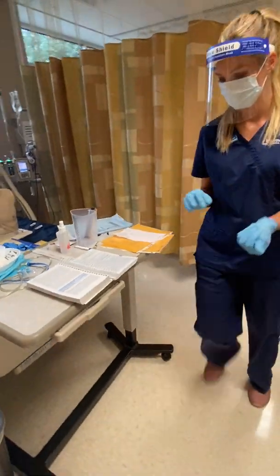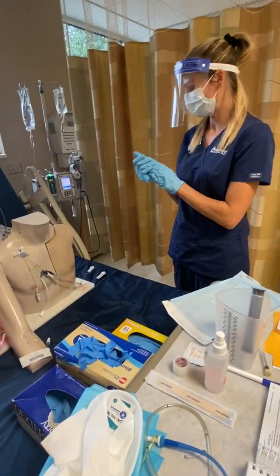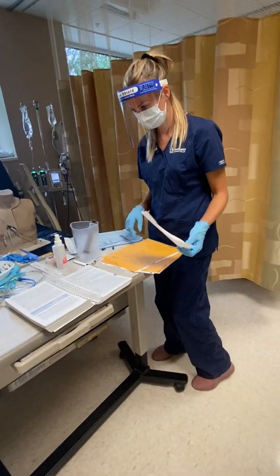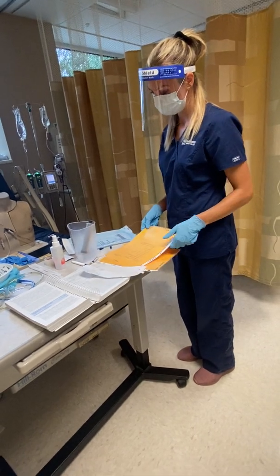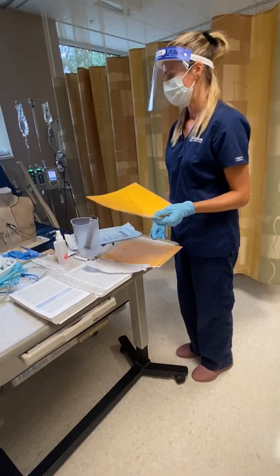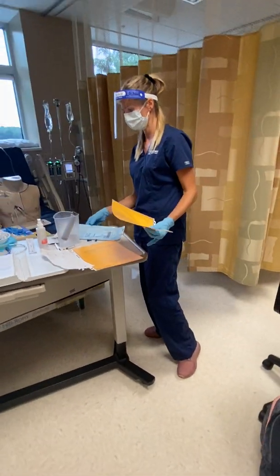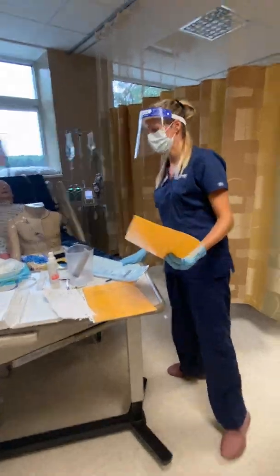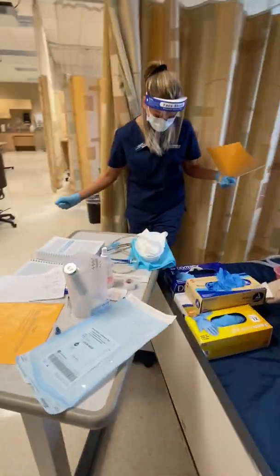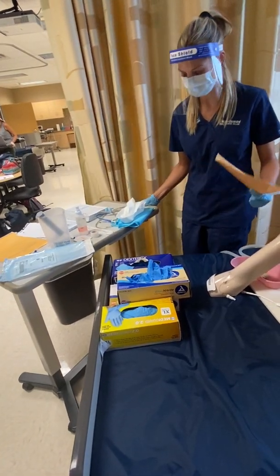Are you doing okay, Jane? Yep, she says she's doing good. Okay, good. All right, so I'm going to wash my hands back up. Okay, so Jane, the last thing that we're going to do is I'm going to get your NG tube going for you, and that is a tube that's going to be going down your nose into your stomach, so that when you're not NPO, because you are right now, we'll be able to get you something to eat that's for your bowel obstruction, okay?